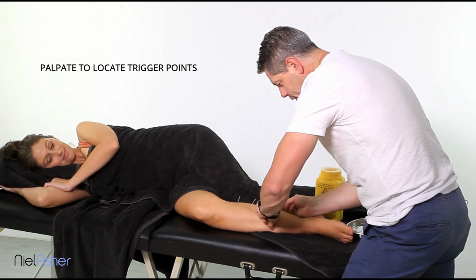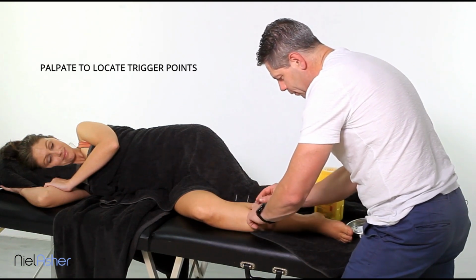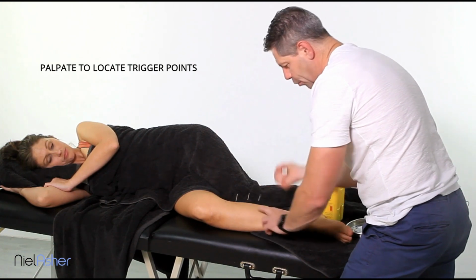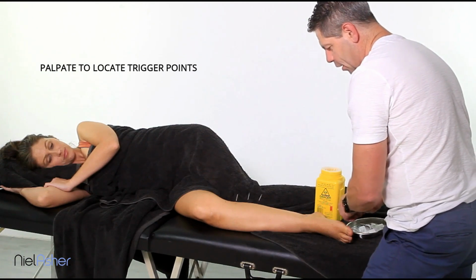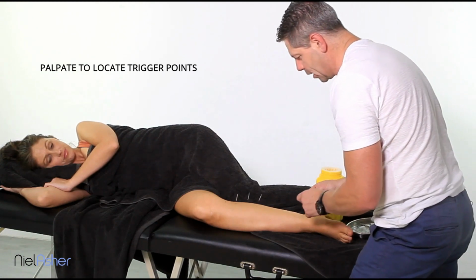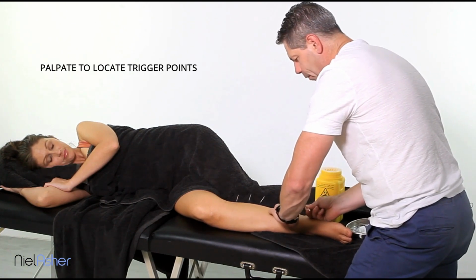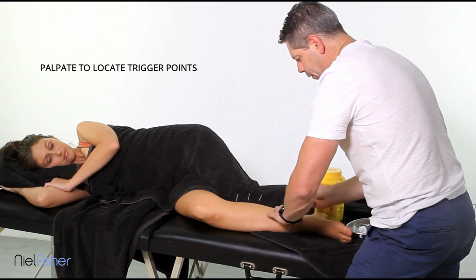Second one, we're going to come down, it's going to be the Flexor Digitorum Longus, which I love saying, which is just about there. So once again, it's just a tad distal, trigger point wise. Same approach, angling in. And then the last one will be the soleus and the medial portion of soleus. So you'll feel it's a lot bulkier. And we have a trigger point right about there.